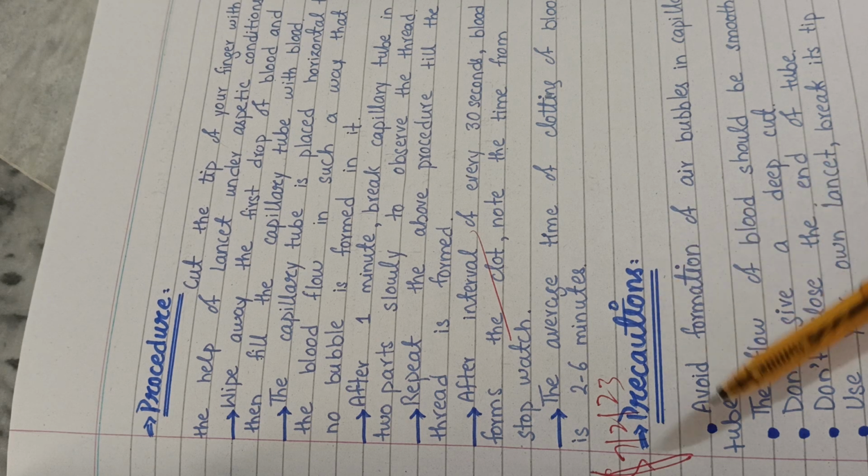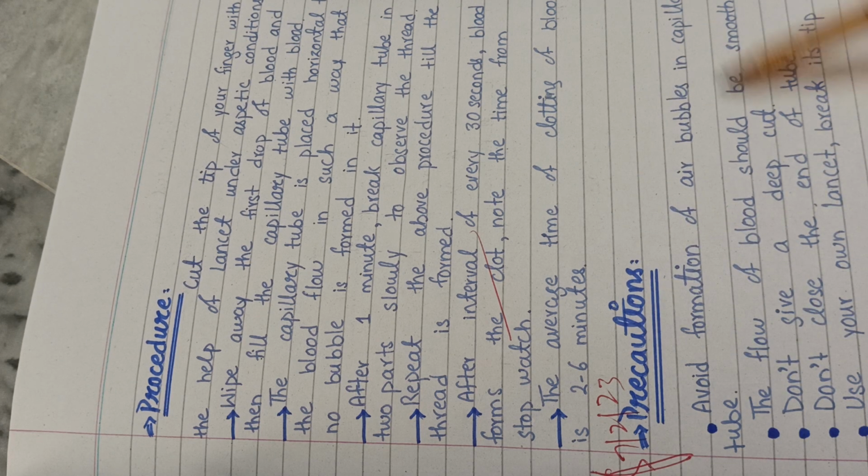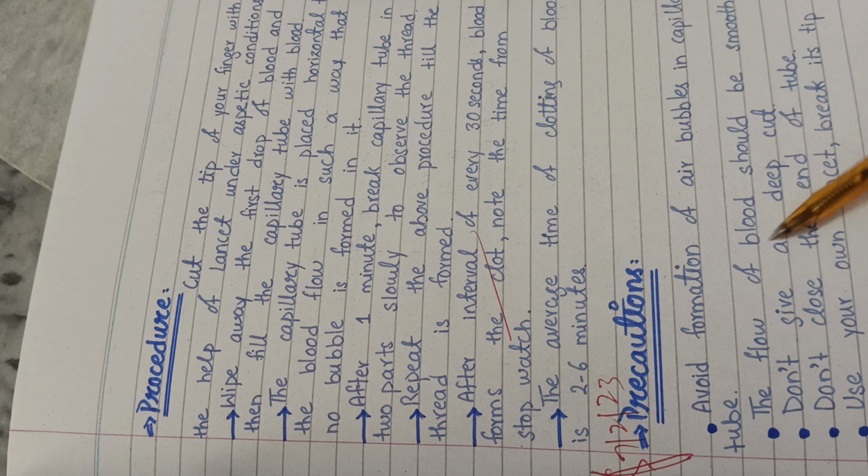And the precautions are that there should not be formation of air bubbles, and there should not be a deep cut. Don't close the end of the tube, and use your own lancet and break it after the use.